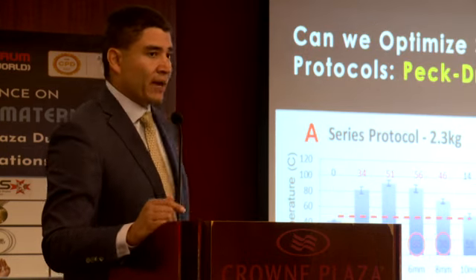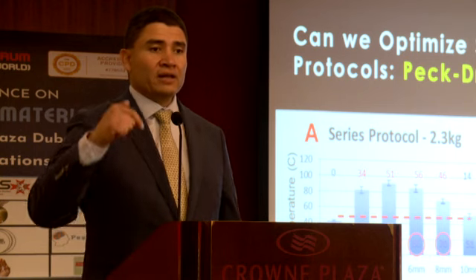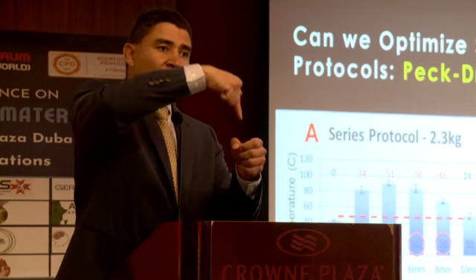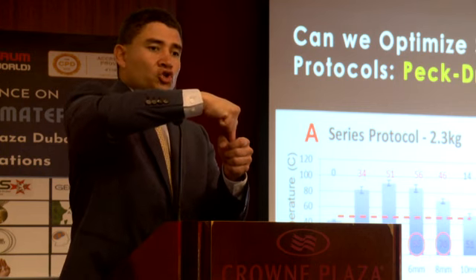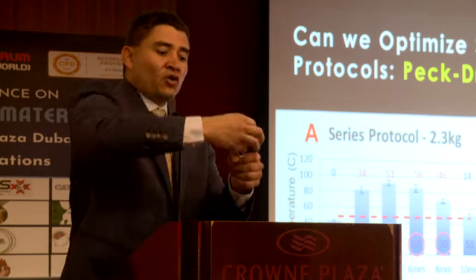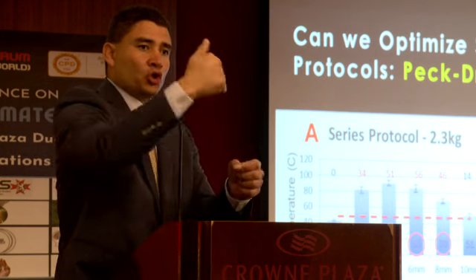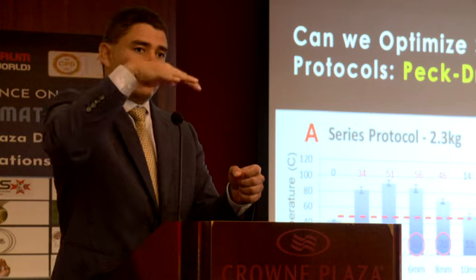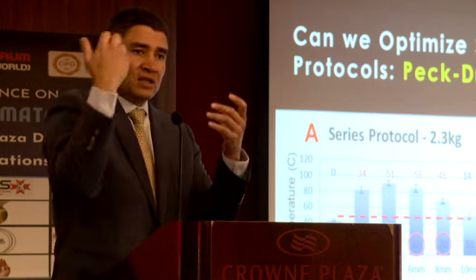Now, what about the drill peck protocol? What does drill pecking mean again? That means the pumping action when you drill, back and forth into the osteotomy, so that the shavings of the bone can be extracted from the osteotomy every time and washed out by the irrigation. Every time you go in and out, you pump things out.